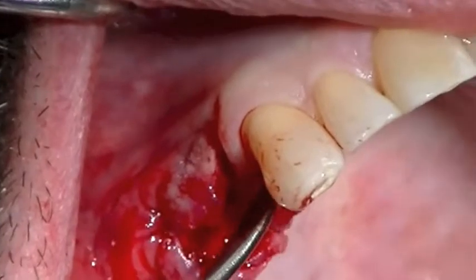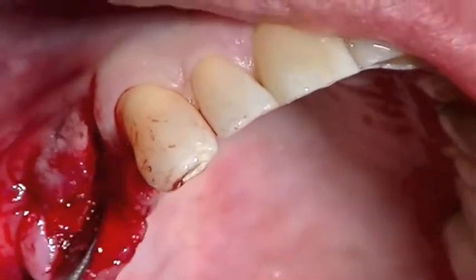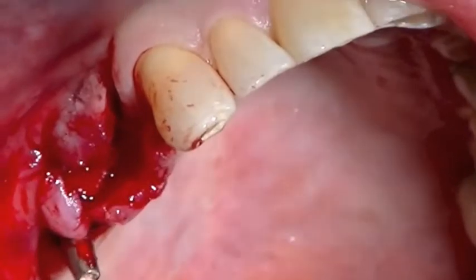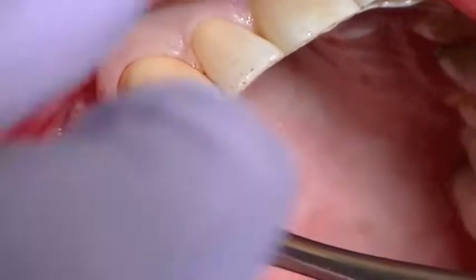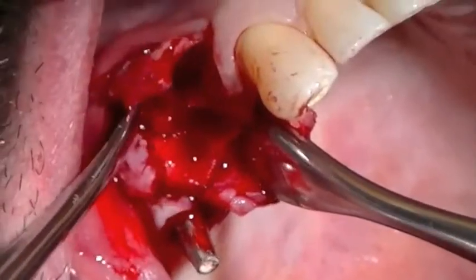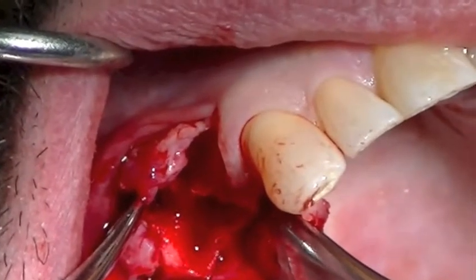We want to be able to place our membrane at least two millimeters apical to the remaining bone surface. So I'm elevating the tissue so that I can place my subsequent membrane properly, so that it's passively placed and won't pull out, and allow us to do a real nice job. Here you can see the significant facial defects that we're trying to correct with our allograft material.